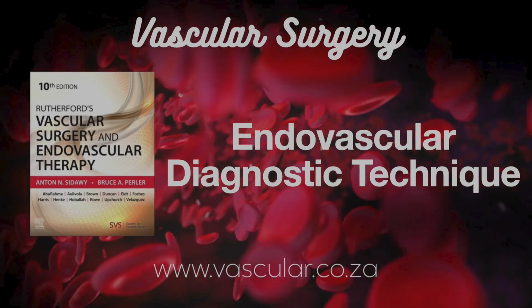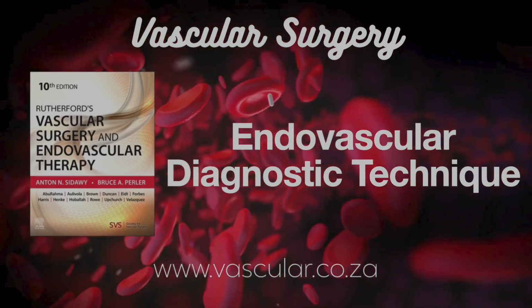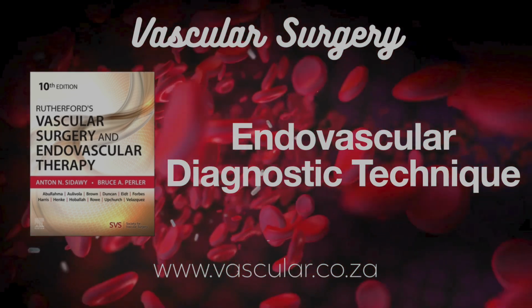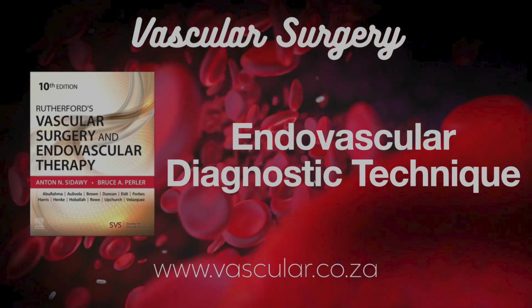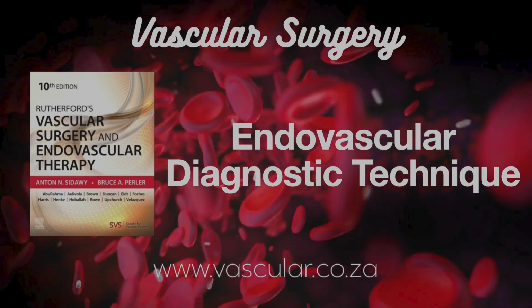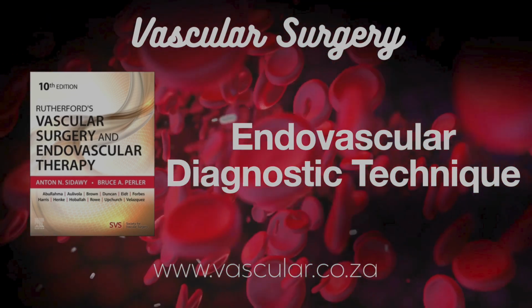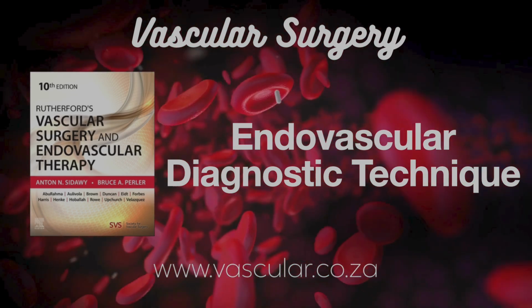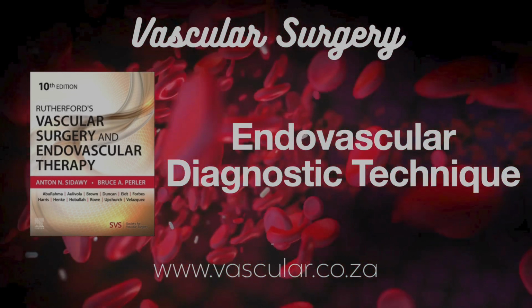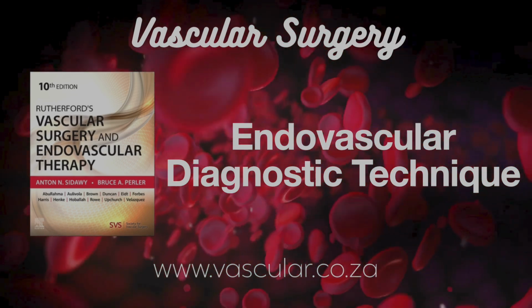Carotid angiography, neck arteries supplying the brain. Sounds delicate. It requires careful technique, absolutely. Step 1 is usually a non-selective aortic arch angiogram. How's that done? Femoral access again. Multi-side hole catheter in the ascending aorta. Power inject contrast, maybe 15 ml/sec for 30 ml total. Often use an LAO view to spread out the arch vessel origins. Is that enough? Often not detailed enough for the carotids themselves.